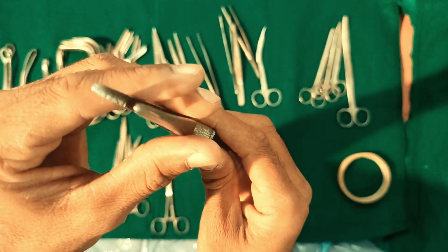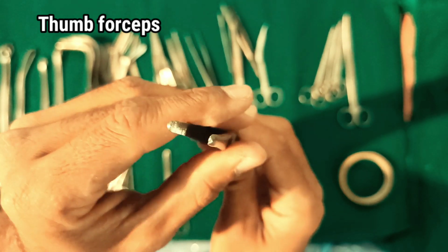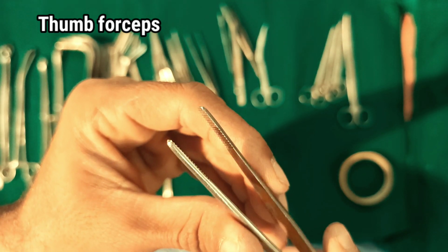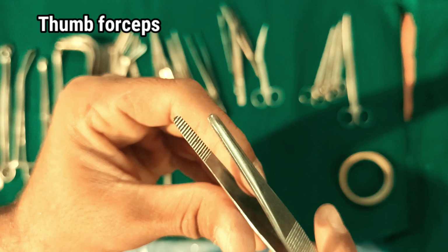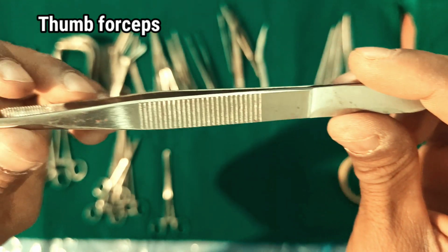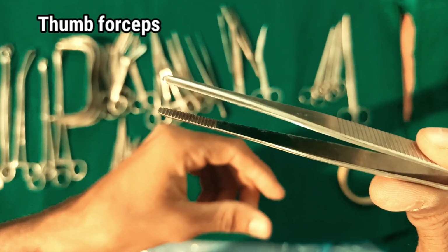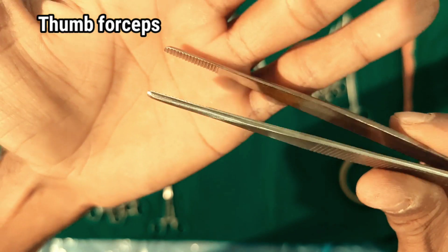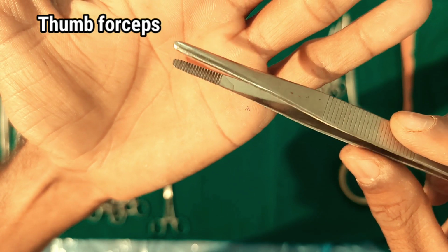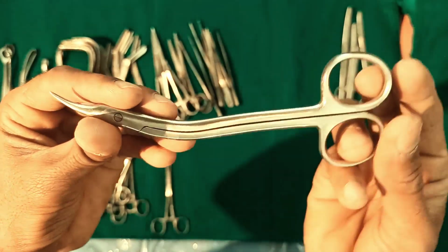Thumb forceps. Thumb forceps are used to hold tissue still when applying sutures, to gently move tissue out of the way during exploratory surgery and to access confined cavities that are hard to reach with hands and fingers. Thumb forceps can have smooth tips, cross-hatched tips, or serrated tips, often called mouse's teeth. Thumb forceps are used for manipulation and grasping of tissues during surgery. They are non-locking, they contain a grasping surface and may not have teeth.